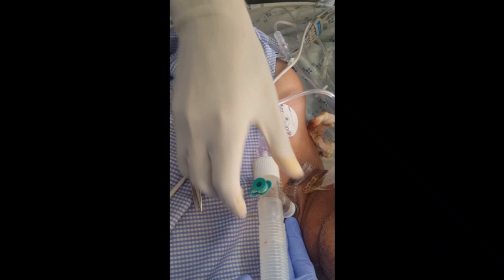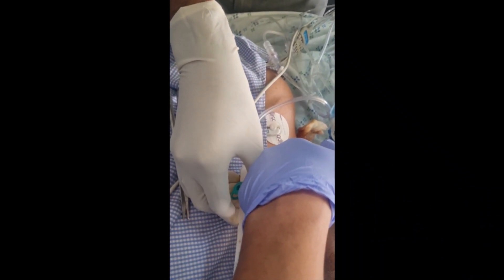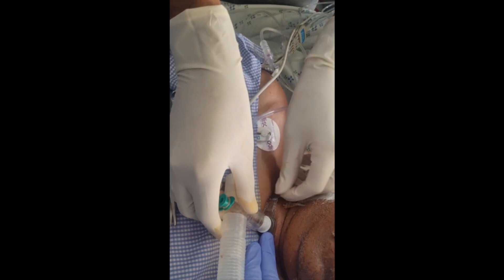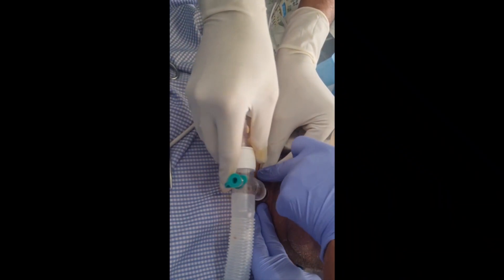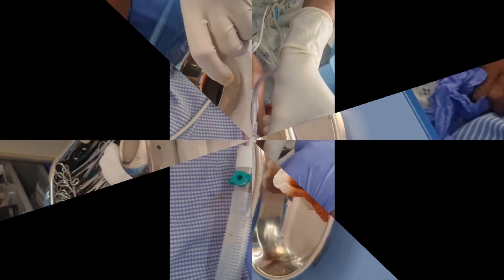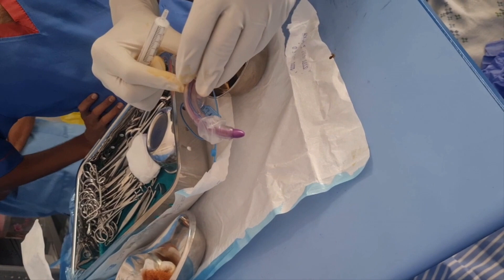We remove the strap around the patient's neck very carefully, and now the assistant holds the flange. It is time to change the tube.